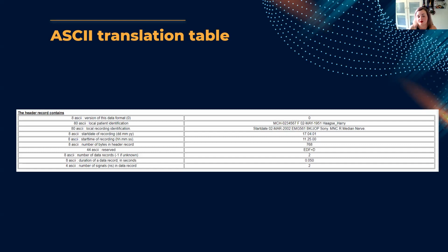But this was just to give you an idea of how looking into data-driven analytics processes, because this is how I came to this information, allowed me to look at the files in their raw format and identify quite quickly if there were any sequences that were out according to the local recording times, because those are supposed to flow. Now, if a patient didn't use it for one evening, there would be a gap in the date and time.